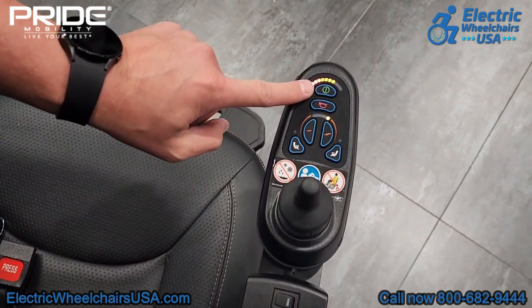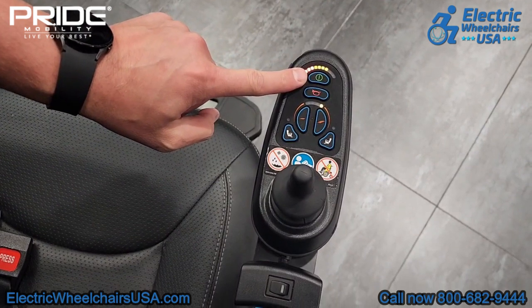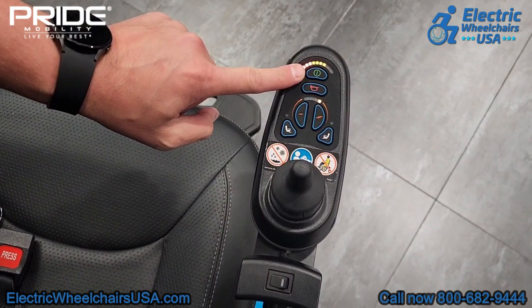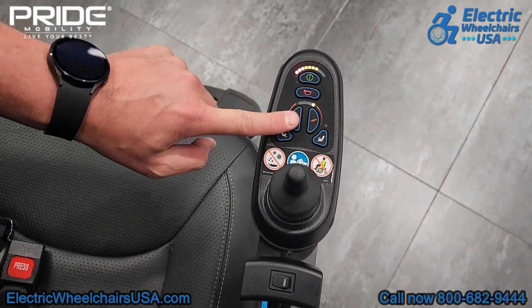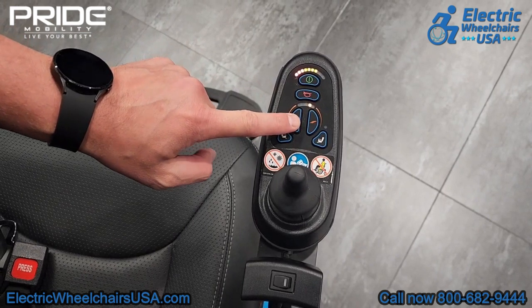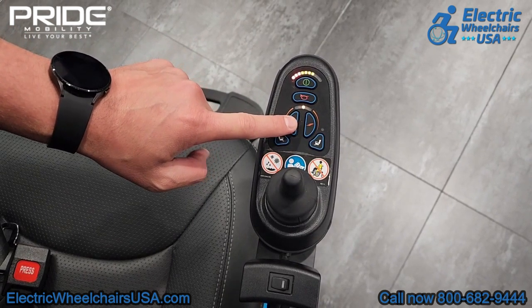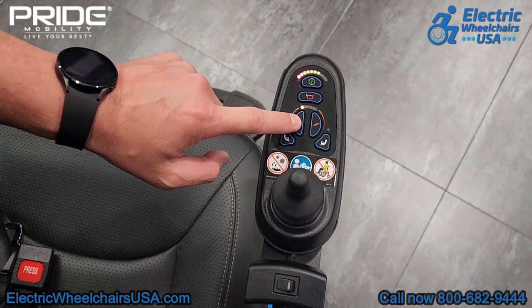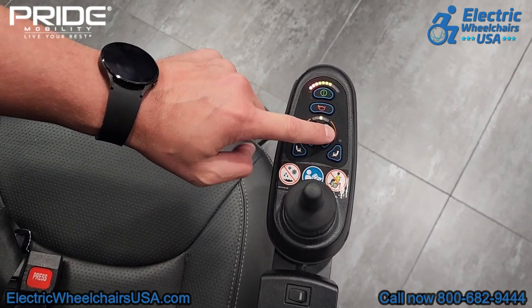On the joystick, the button up top is your on/off switch. Right above that is the battery gauge — it's about 60% charge right now, and once it gets down to the last one or two dots you'll know it's time to recharge. It also comes with a horn. This is your speed control dial — turning it all the way down gives a top speed of around two miles per hour, and turning it all the way up gives a top speed of around four miles per hour.